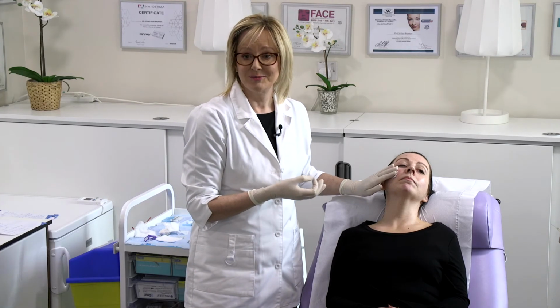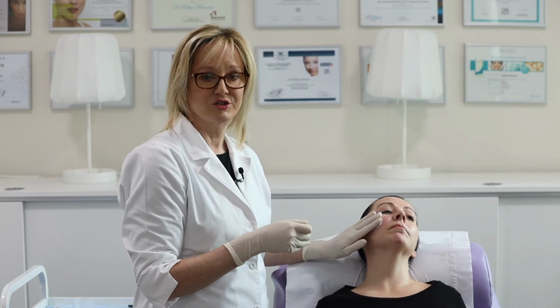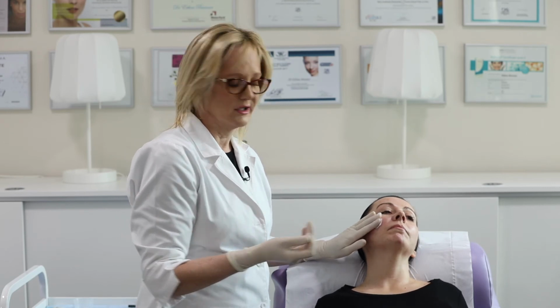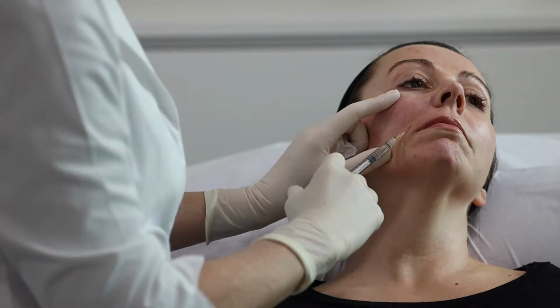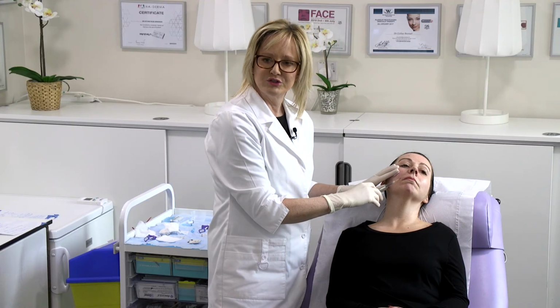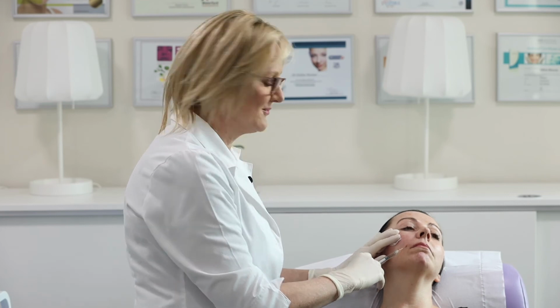I'm now going to give some subdermal support to the nasolabial fold, and my preference is to use a cannula here. If the canine fossa is very retruded, I could go in and go deep on bone with a 90-degree angle, but today for my young patient who's 42, I'm going to use a cannula. For my patient today, I'm going to use 0.2 cc's in NL1. I'm going to use 0.2 in NL2 and just 0.1 in NL3, and that'll give some support to the area.